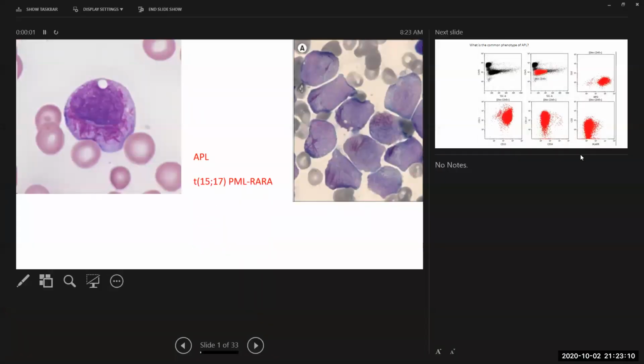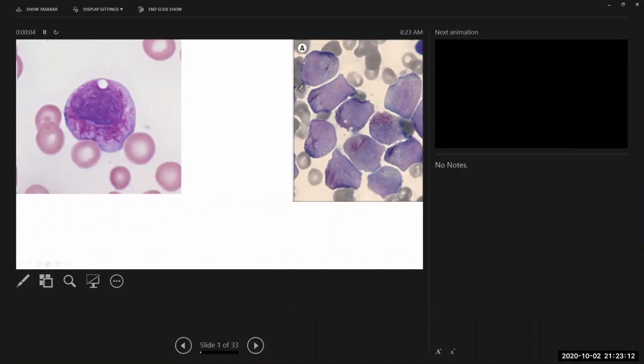All right, this is going to be kind of rapid fire. It's all morphology, so you guys will be pretty good on all this. There's a few things I kind of left out, but we were going to maybe add a few things over the weekend and have this available in the M drive for people to review, especially for boards.